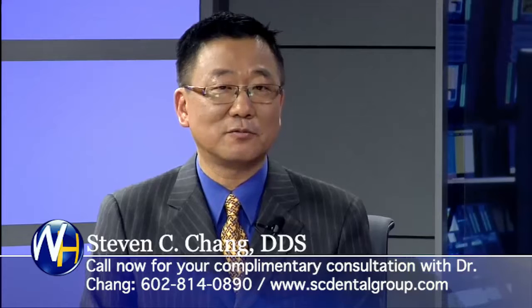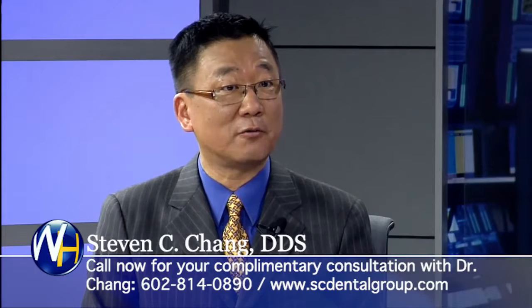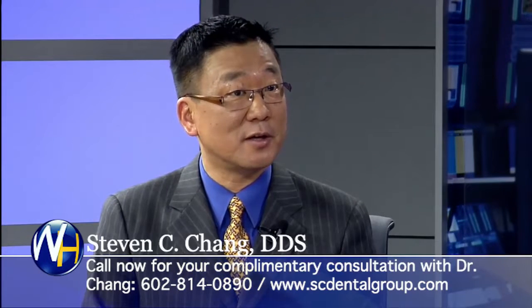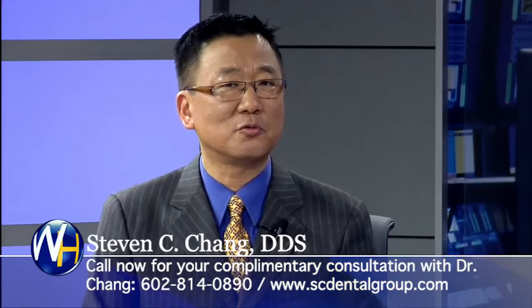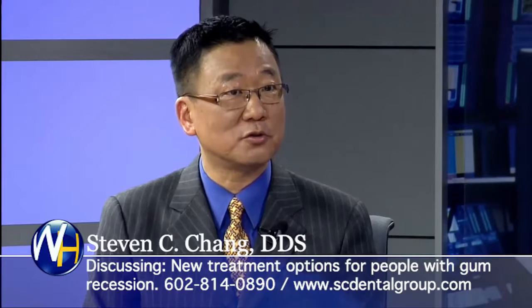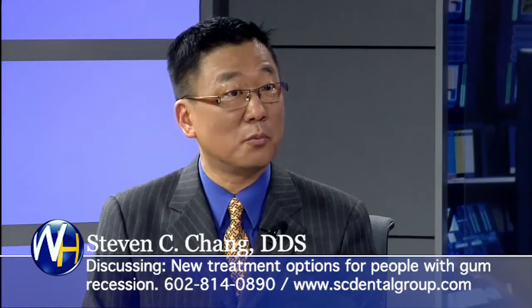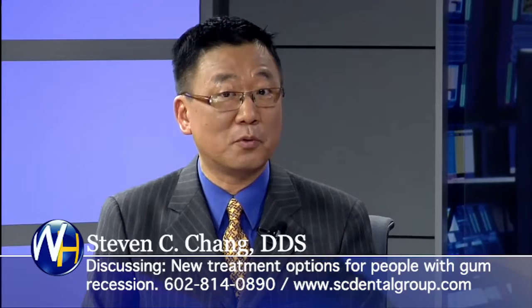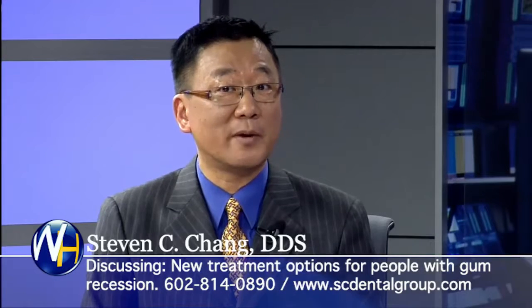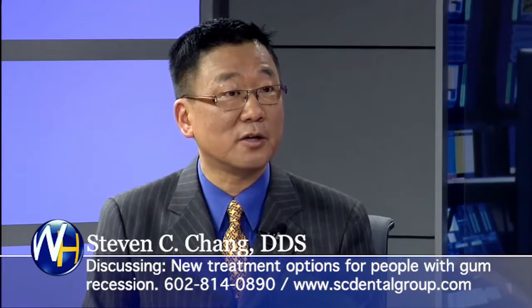First of all, the patient needs a thorough exam. We take intraoral camera photos, and we need to borrow their full mouth X-ray to see whether the patient has gum disease or not, or existing bone loss. We address the issue. We try to find the causes of this gum recession, and we try to control this issue before scheduling the patient. And also, we are using a 3D cone beam CT scan to make sure we provide the right treatment on the right sites, and the patient will be educated on what the problem is and what can be done with this pinhole surgical technique. We're out of time.